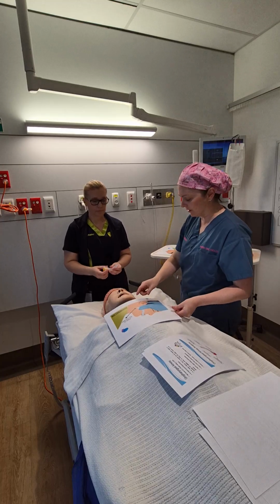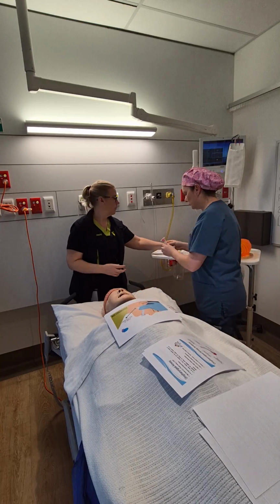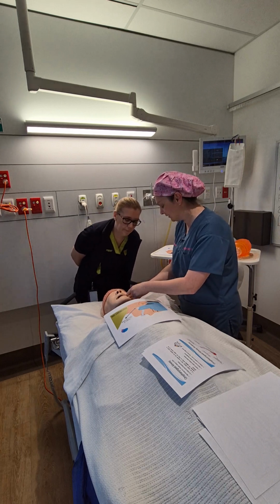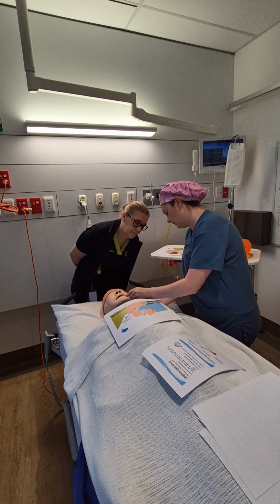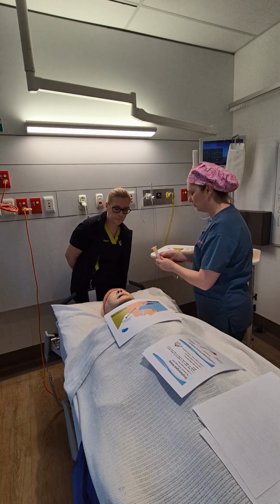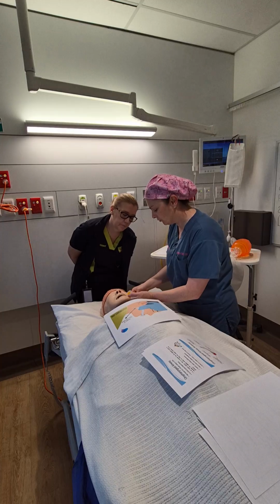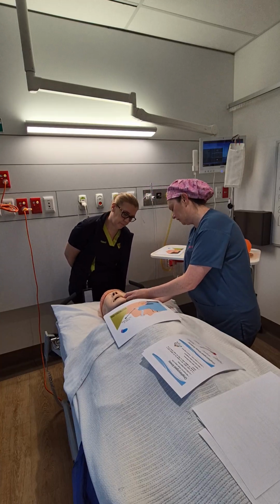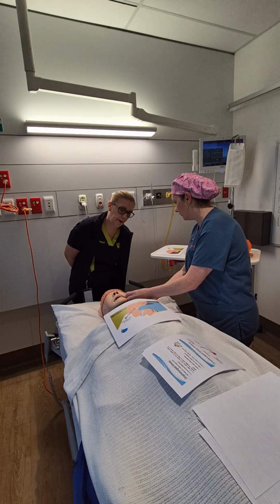So I'll leave that one there. I'll grab this one, so you can see that we go from the corner of the lips, or from the teeth, so hard, and then we go across the jaw to there. So you can see this one's too big. So we'll just try the next size down. We'll go for this one. So we go from the corner of the jaw there, across the top, and you can see that that one goes right to the angle of the jaw, and that one's much better for you.